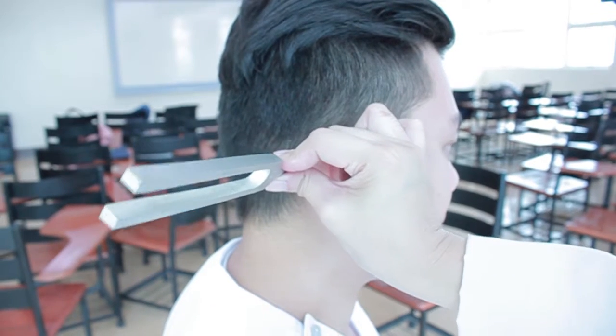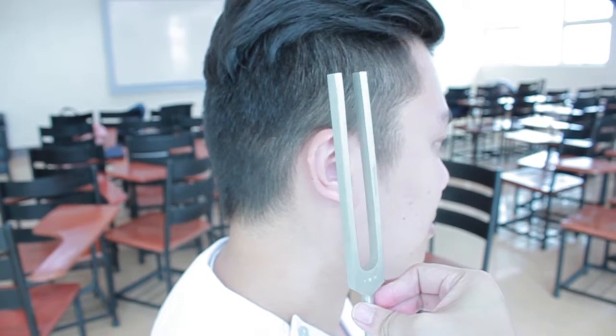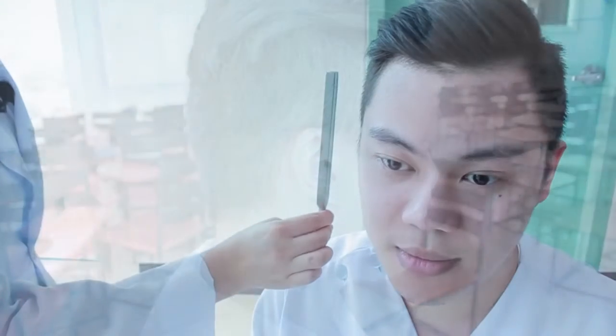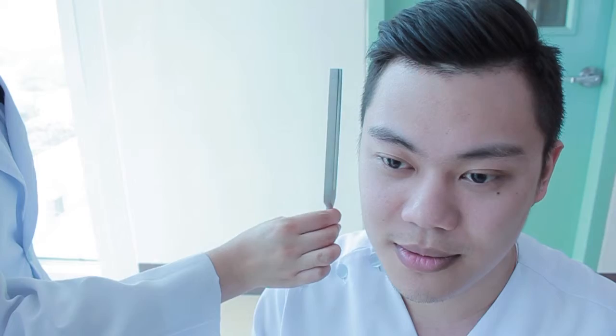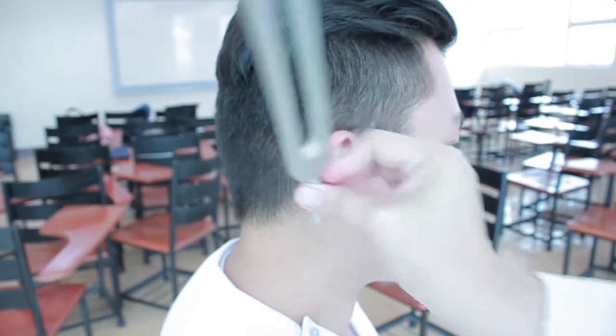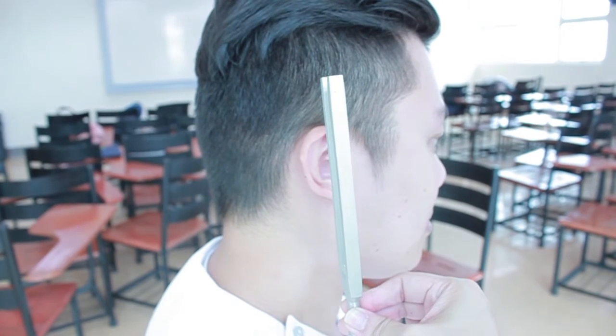It is important to remember that when putting the tuning fork in front of the ear canal, put it in either a perpendicular or parallel position. A normal response would be that air conduction is greater than bone conduction. If the conductive hearing loss is large enough, then bone conduction will be equal to or greater than air conduction. A normal Rinne does not rule out the possibility of a sensorineural hearing loss. When the Rinne is normal, it is reported as positive. However, this is rather confusing in that most positives indicate abnormal tests.